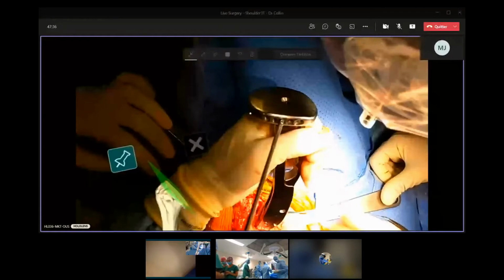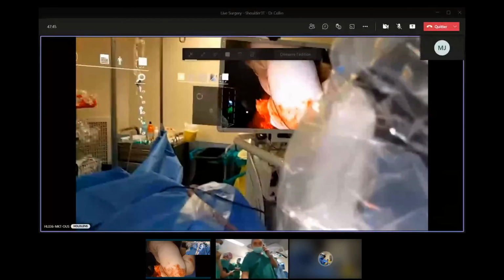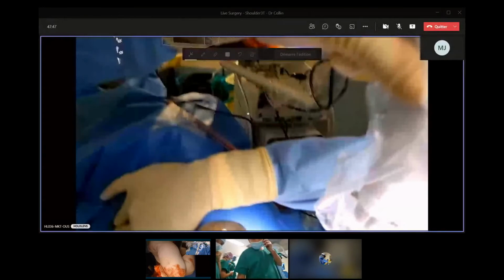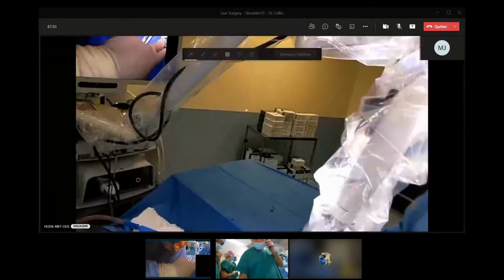Maillet, on a toujours besoin de ça du coup, mais faire attention, elle est plus stérile. Vas-y, continue Charles, parce que tant qu'à faire. Ouais, mais si c'est pas stérile, faut pas la garder.